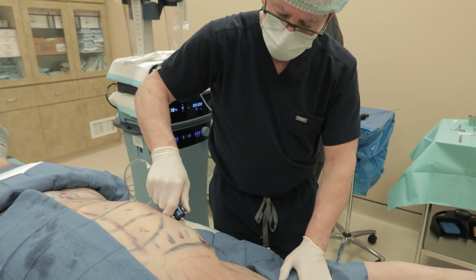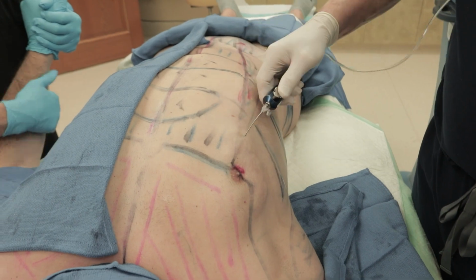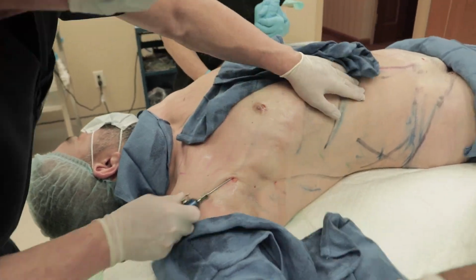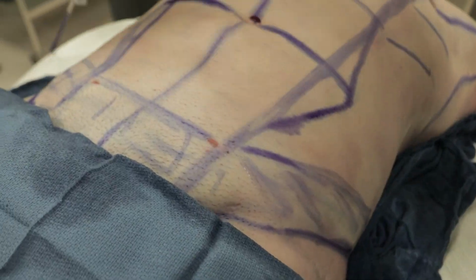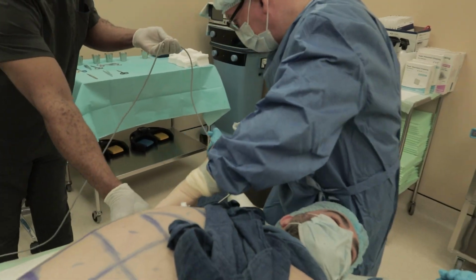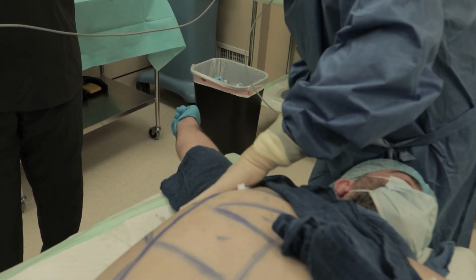We've got some scar tissue here, but I'm right where I want to be. And as they always say, we pump you up. And we are here to pop you up. All right, guys, so here we are. In the armpit. Lift up that armpit. Good. And we're getting this space between the lats back here.